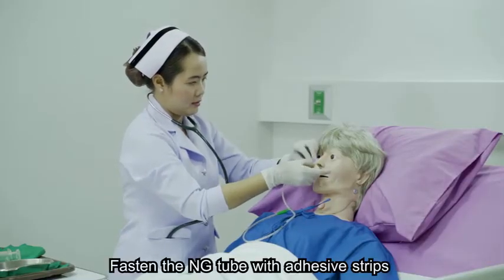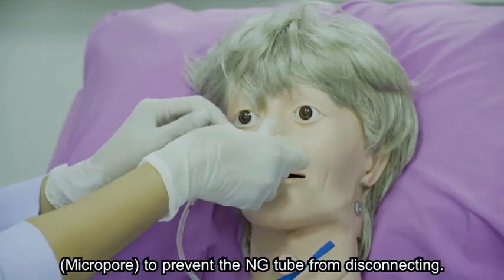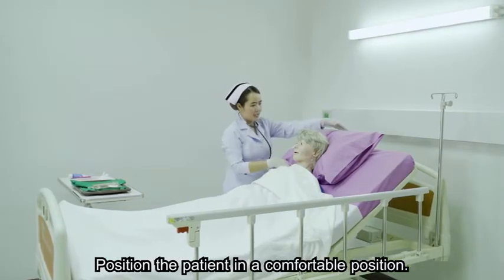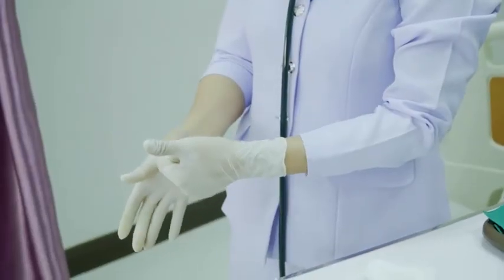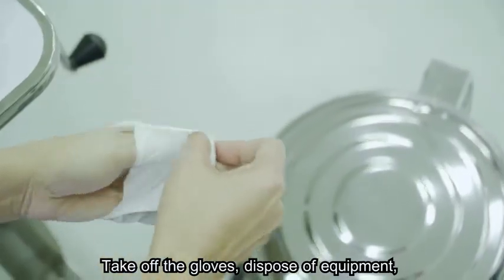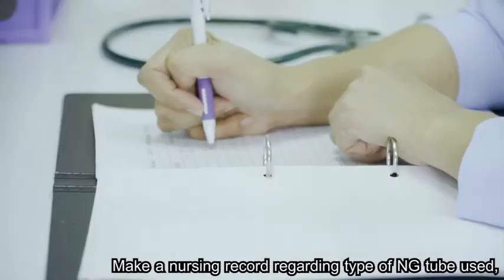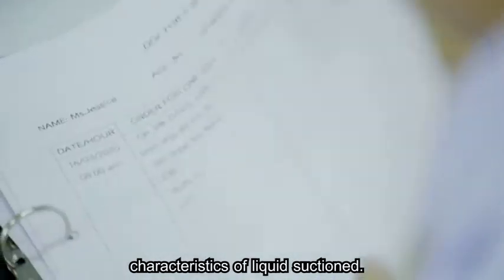15. Fasten the NG tube with adhesive strip or micropore to prevent the NG tube from disconnecting. 16. Position the patient in a comfortable position. 17. Take off the gloves, dispose of equipment, then wash your hands thoroughly. 18. Make a nursing record regarding the type of NG tube used and the characteristics of the liquid suctioned.